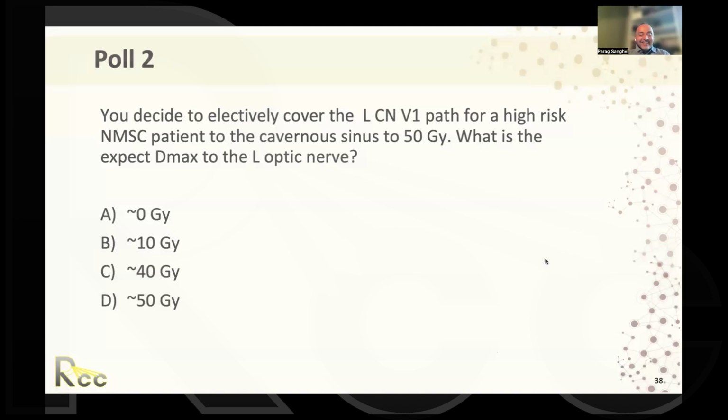That's exactly right. So I just wanted to make the point, you can't spare the optic nerve, right? So this is exactly the thing that I wanted to make sure that you got. Very good. All right, everybody's listening.